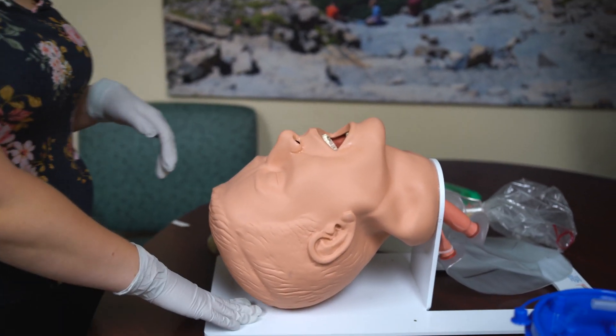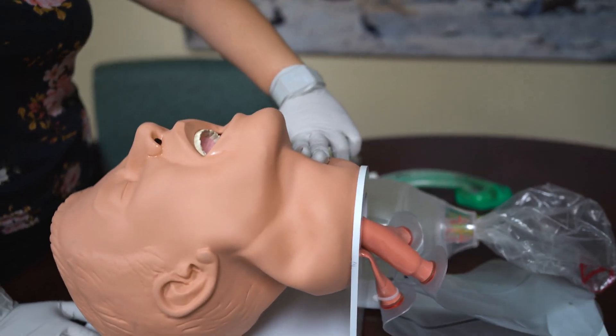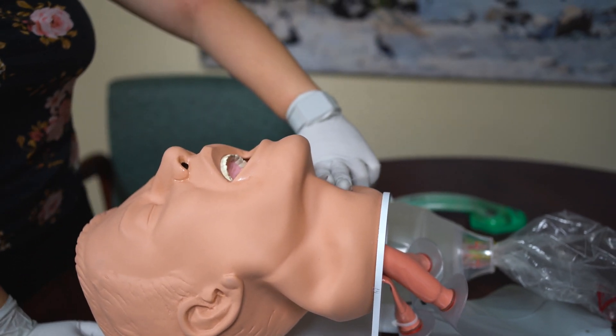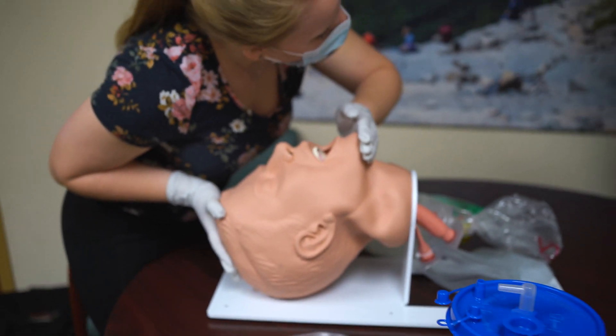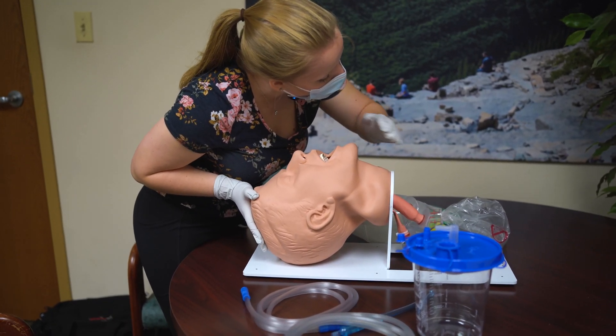My patient's unresponsive, so I'm going to palpate a carotid pulse for no longer than 10 seconds. I feel a weak pulse, so I'm going to consider requesting backup right now. Then I'm going to do a head tilt-chin lift — I'm going to listen and feel for breathing while watching for chest rise and fall.